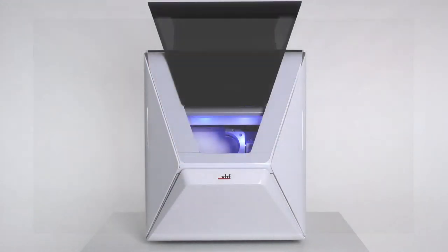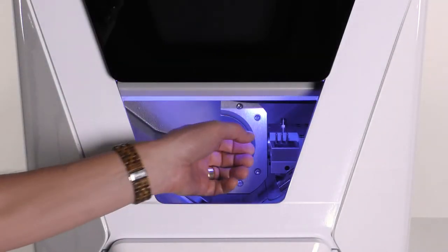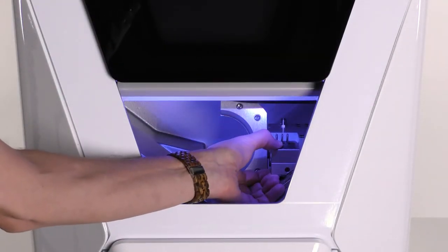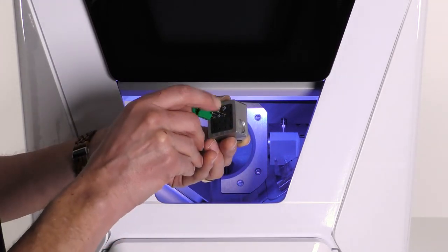Since changing the tool magazine inserts is slightly different for the R5 and N4 Plus than for the S5 and K5 Plus, we will show you both procedures. If your machine is an R5 or N4 Plus, do the following steps: pull the tool magazine out of the working chamber and remove all tools from the tool magazine.